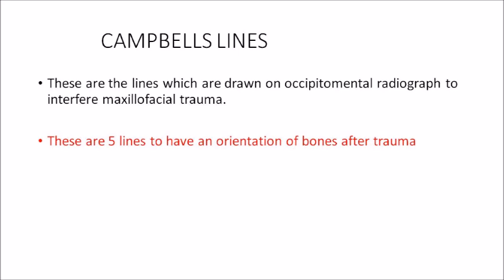The next important topic is Campbell's lines. These are lines drawn on the occipitomental radiograph to assess maxillofacial trauma. There are five imaginary lines used to determine the orientation of bone after trauma and bone displacement. These five lines are used for the proper assessment of maxillofacial fractures.